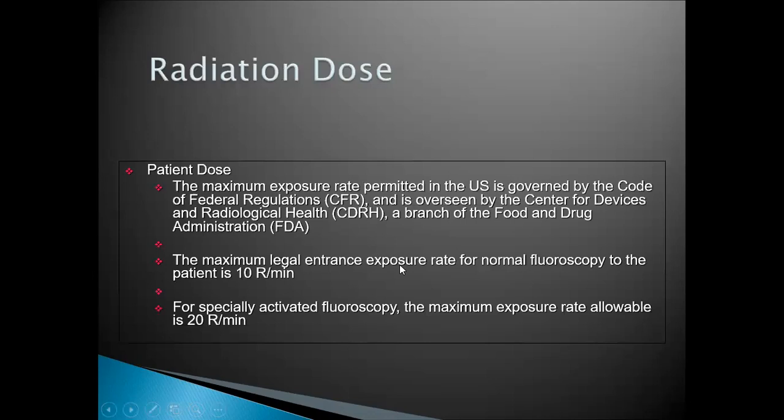Regarding patient dose, the maximum limit, we know it is 10 R per minute for continuous fluoroscopy. Then for special activated fluoroscopy, you can go as high as 20 R per minute.